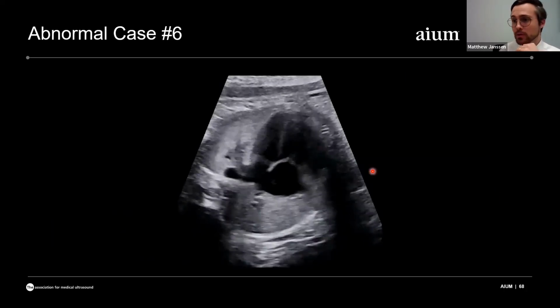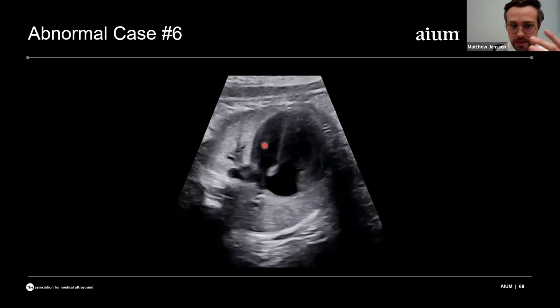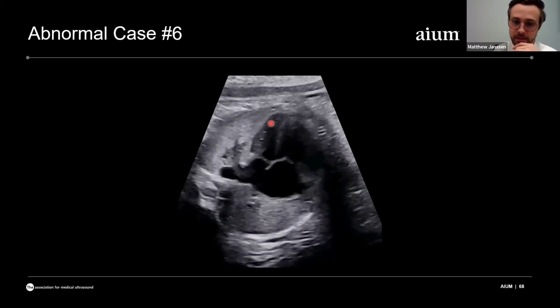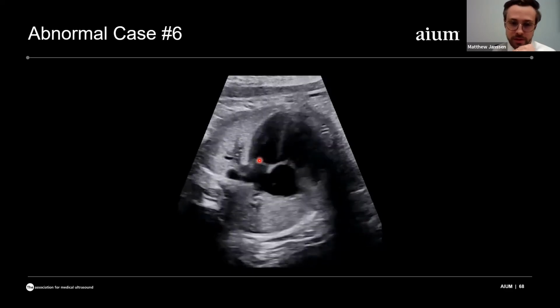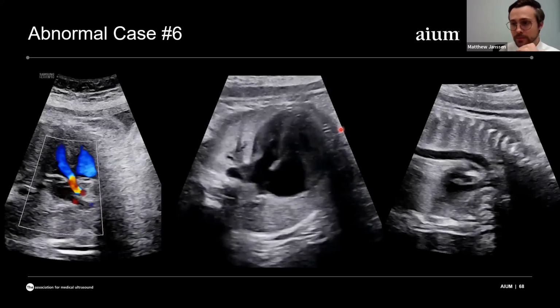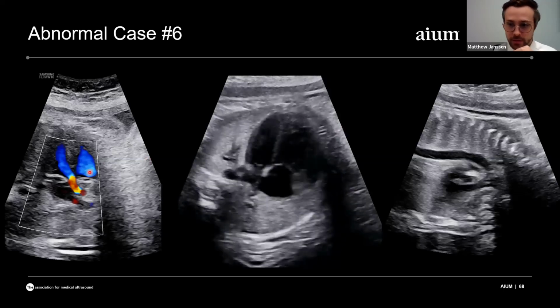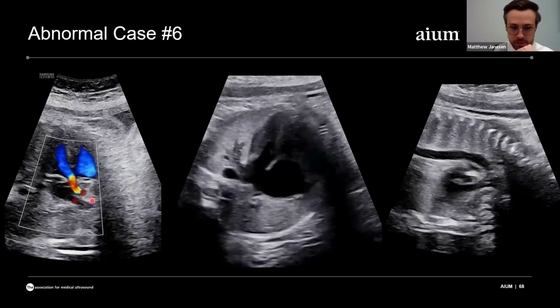And then we start looking at the 4-chamber and we see an RV to LV size discrepancy here as well, that this LV seems to be underdeveloped, although it is apex forming, and it does seem like it has a normally functioning valve and normal contraction function. And then we go to our outflow tracts here with the left ventricular outflow tract, and we see some increased velocities and turbulent flow through the left ventricular outflow.